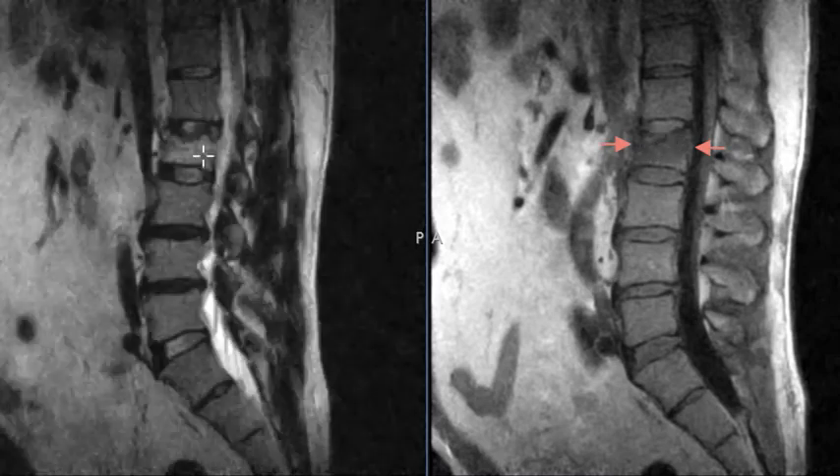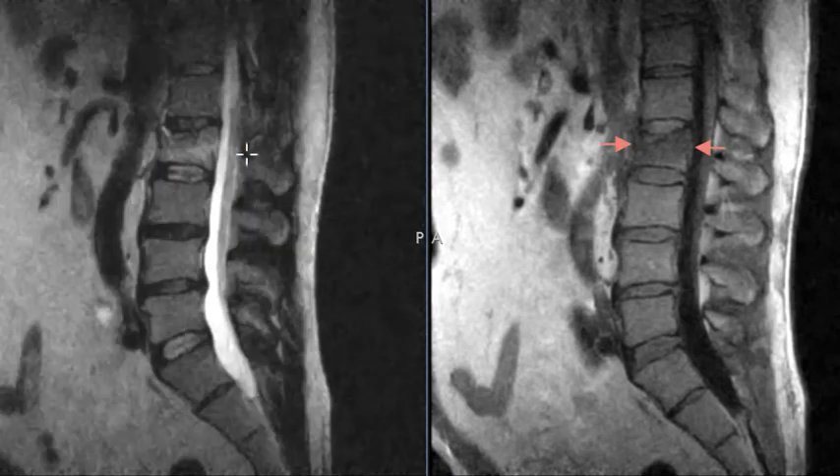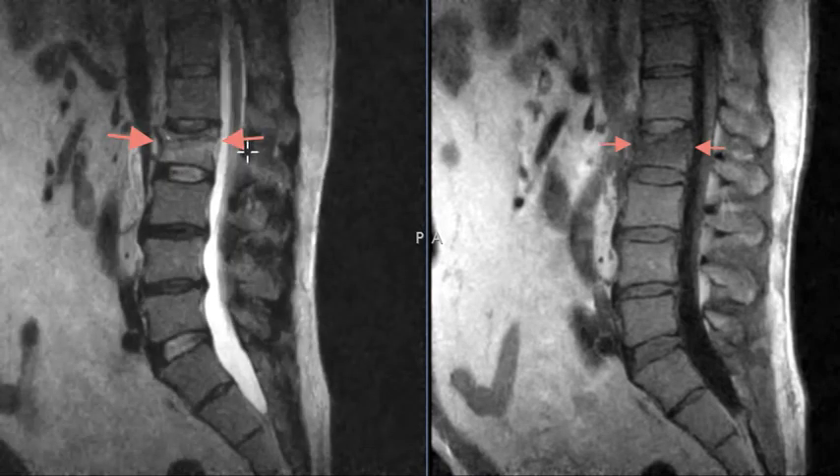On the T2 image, fluid is white, so the bone is more white because it has fluid signal within the vertebral body. So this is an acute compression fracture.